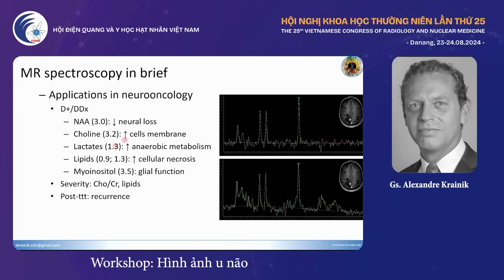The choline is another peak, which is normal. It's related to the density of cellular membrane, and normally choline should never be above the peak of NAA, and roughly not so far above the peak of creatine, which is just beside. Those are normal peaks, okay? Creatine as well, but we don't really care about these peaks.